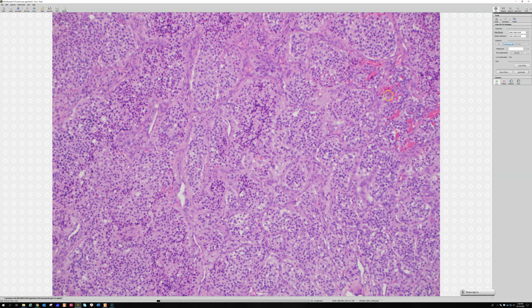And one place in the body where paragangliomas particularly tend to have a lot of keratin is near the sacrum. Sometimes paragangliomas occur right around the presacral area or in the filum terminale region, and they can have a lot of strong keratin expression there and totally make you think of a metastatic neuroendocrine carcinoma. So that's a really important pitfall to be aware of.